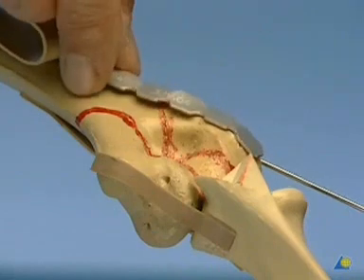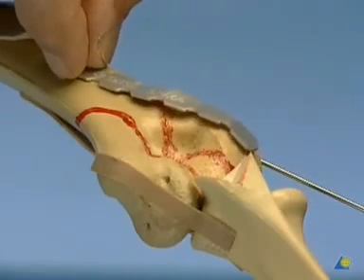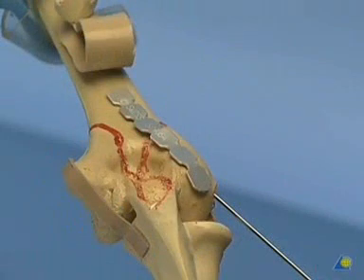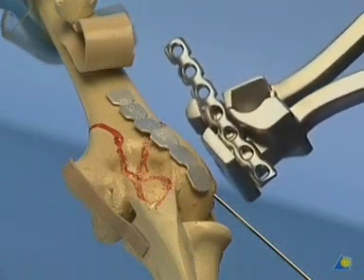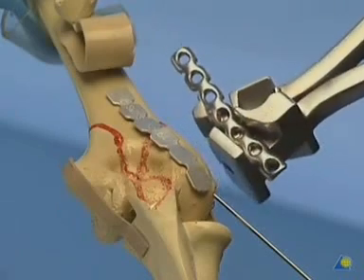The template of a 6 or 7 hole reconstruction plate is placed on the dorsal-radial aspect of the bone. As the articular surface does not extend far posteriorly, the plate may be contoured and bent accordingly with the special pliers. Much care has to be taken for accurate contouring.